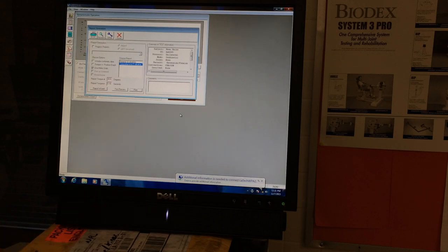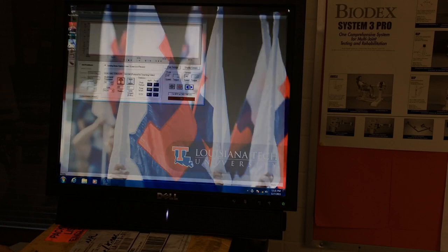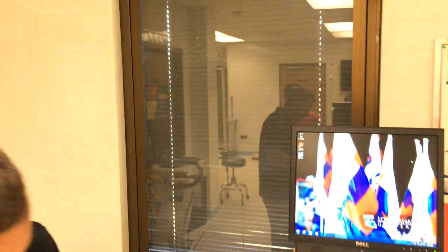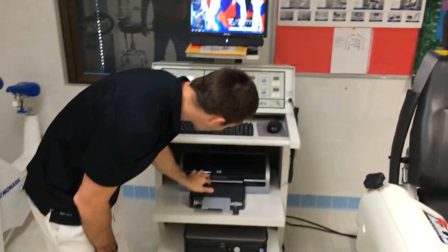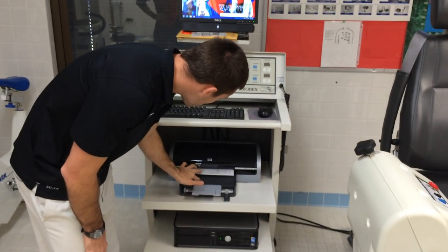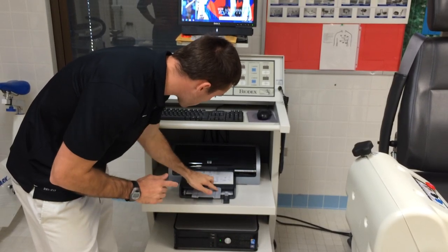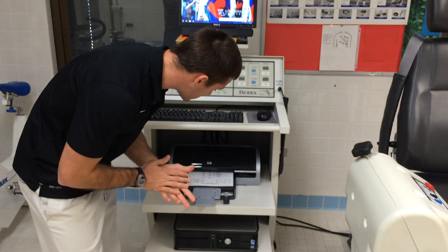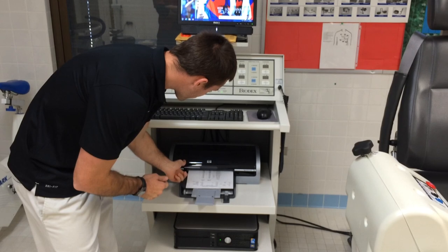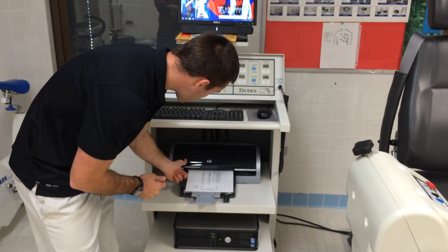The test is now done. All we have to do at this point is hit close. We can close out our software here and we are all done. So now we'll generate our report. And depending on what you're doing with the study, it will depend on whether or not you actually are distributing this to your subjects or not. A few more seconds here to finish up.